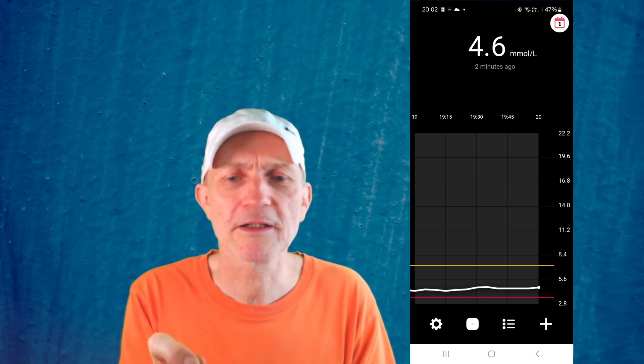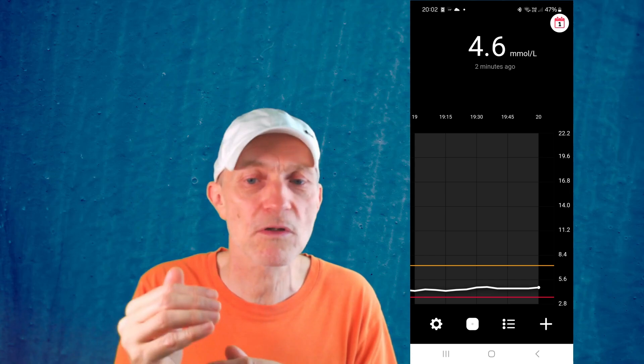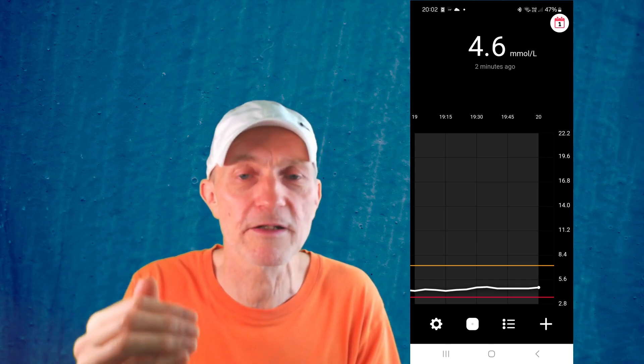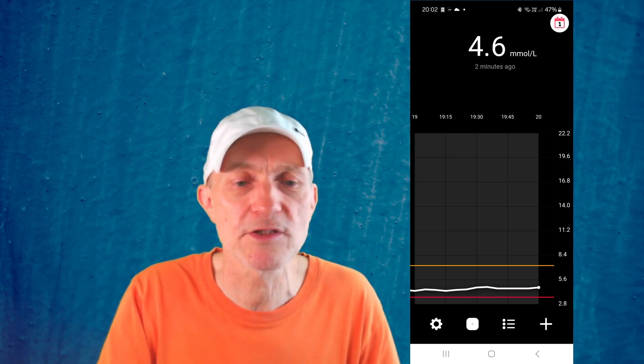The zooming requires touching the screen at a very specific location for it to work — I didn't find that intuitive. I also found that the vertical scale of the app is not configurable; it goes all the way up to the maximum value of 22 millimoles or 400 milligrams per deciliter. It would be nice if you could choose that range yourself.